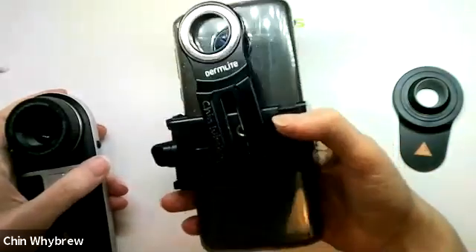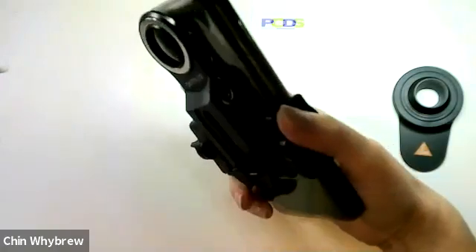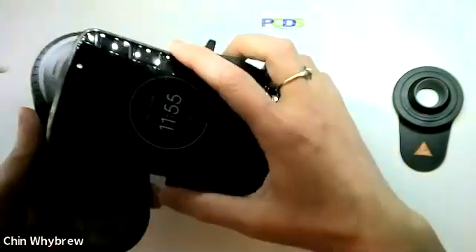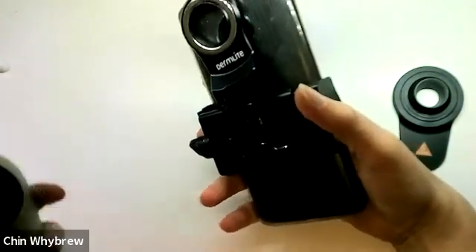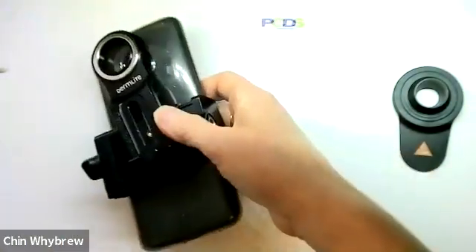This universal Dermalite adapter will fit onto the Heine Delta 1, it will fit onto the Iluco IDS 1100, and it will also fit onto the Dermalite dermatoscopes as well.